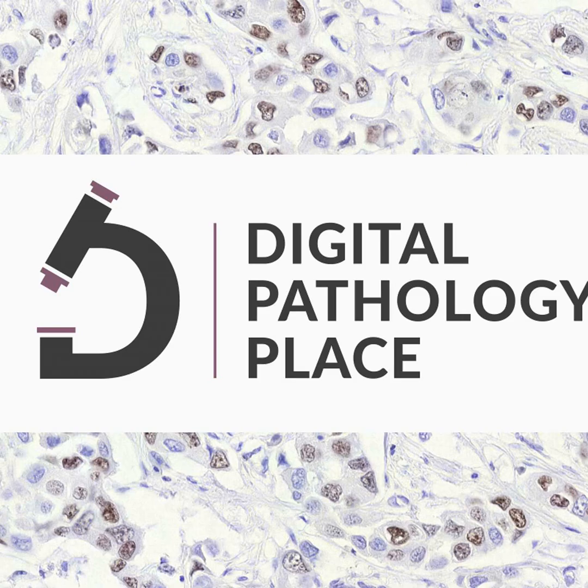Developing algorithms for image analysis is not simply a matter of plugging in data and letting it run. Rather, it involves meticulously curating the data used, ensuring that each image is of high quality, devoid of distortive artifacts, and correctly annotated. Concurrently, performing thorough control checks on the quality of the output is not an optional step, but an essential part of the process.